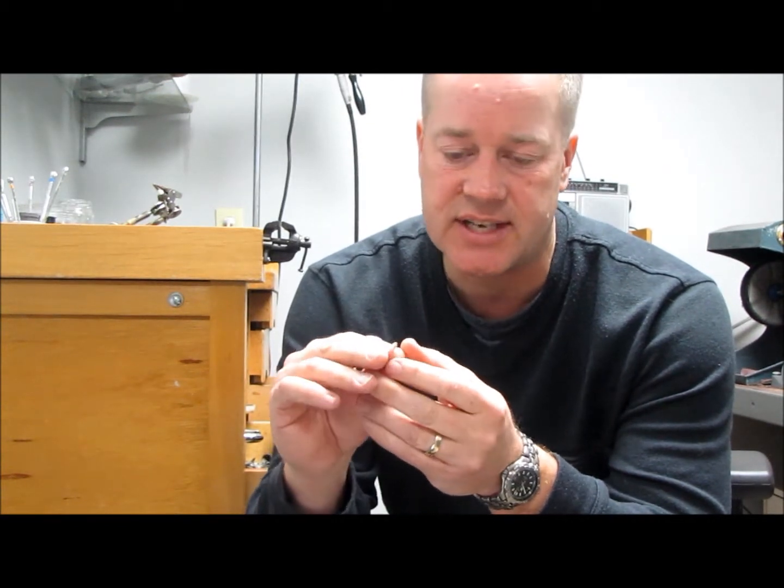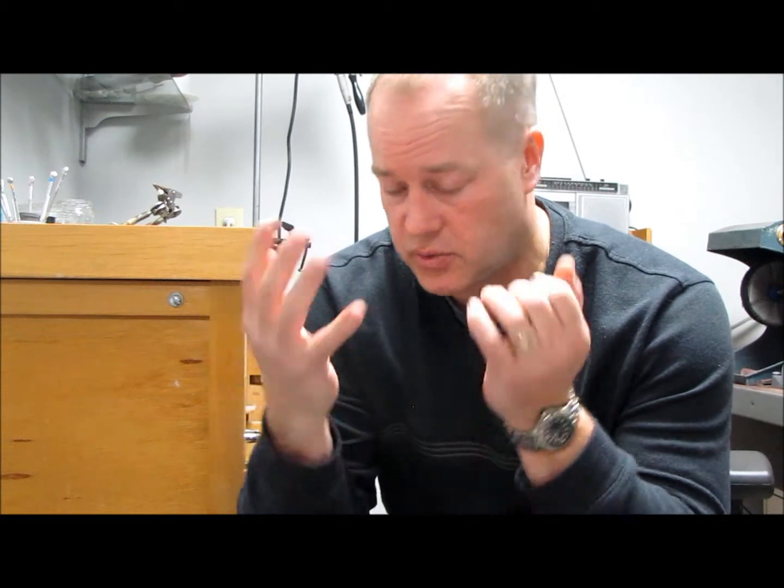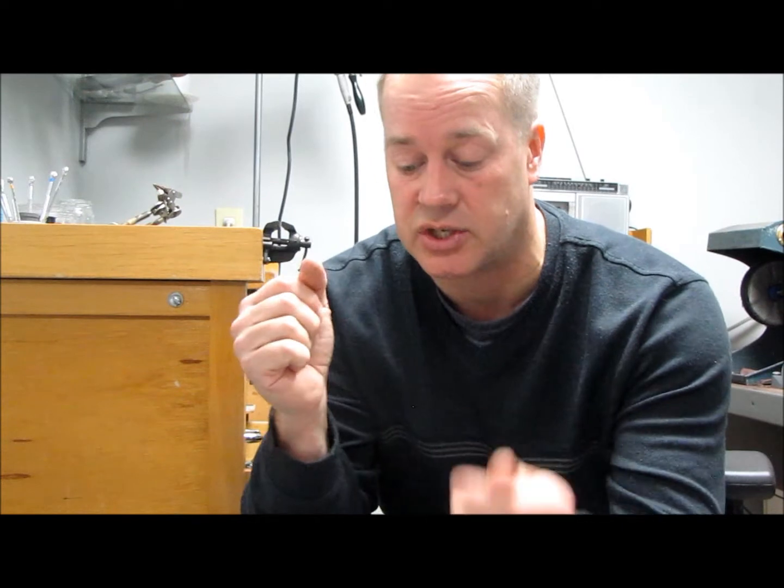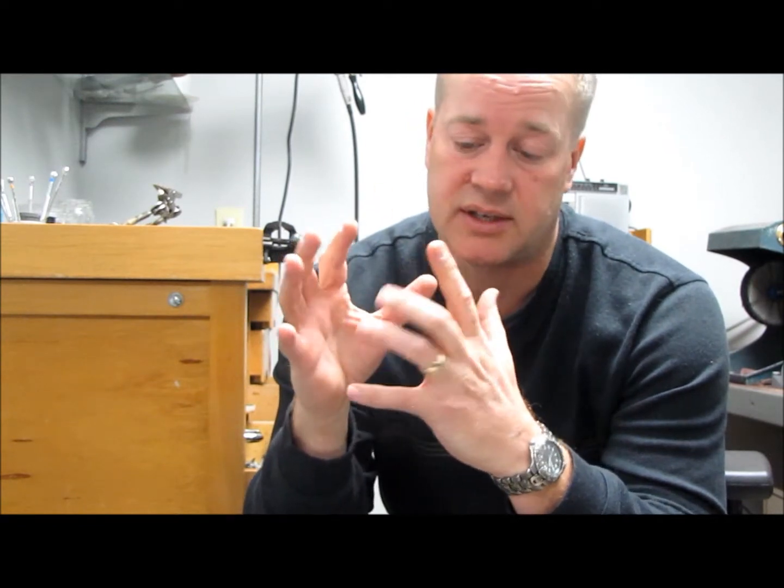Ehlers-Danlos is a condition of hypermobility throughout the whole body. What I do is focus on the hands and the fingers, and the splints that I build are to stop hypermobility, to stop the hyperextension. This is about as far as I can extend my fingers. Someone with Ehlers-Danlos can bring them way back. They can sometimes touch their wrists. It gets to be an issue because when we hyperextend, we can lock. It's very painful, and it's difficult for people who have Ehlers-Danlos to even function. So in Canada here, I can help.